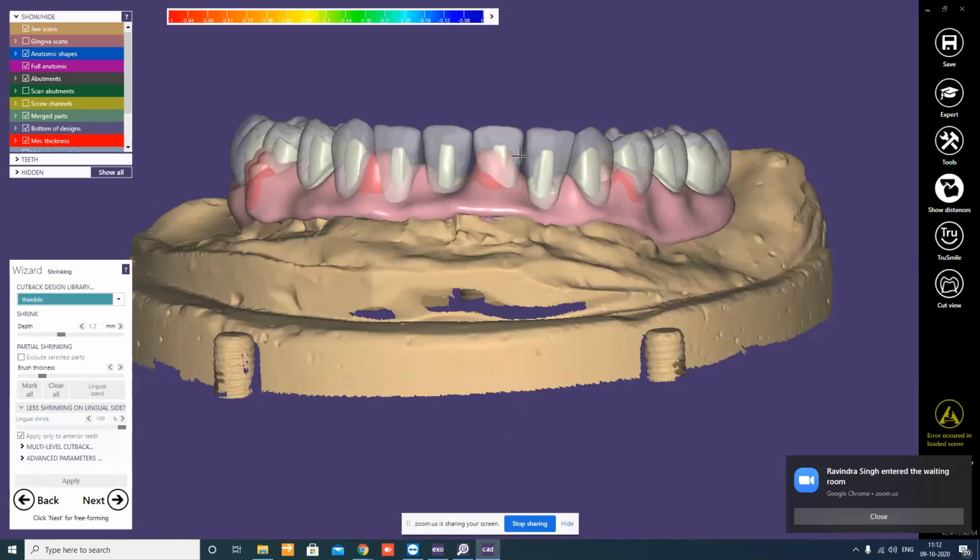Okay, here we are. Now sharp edges should not be there, whether it is zirconia or whatever material. So we can just slightly smoothen this, so we can provide a better surface for the superstructure to come. Now I see this part, we'll quickly remove that also, and we correct the sharpening by smoothing of the sharp edges quickly.